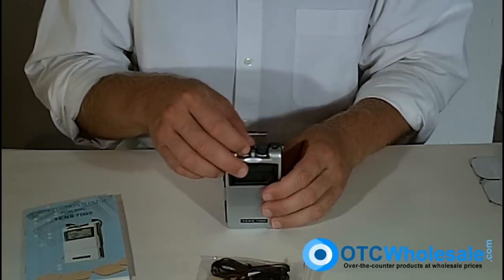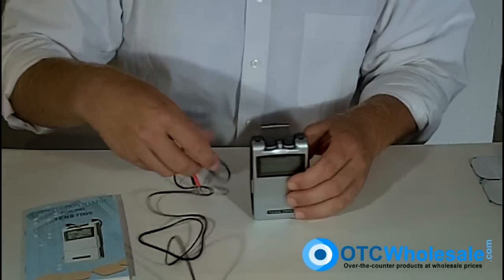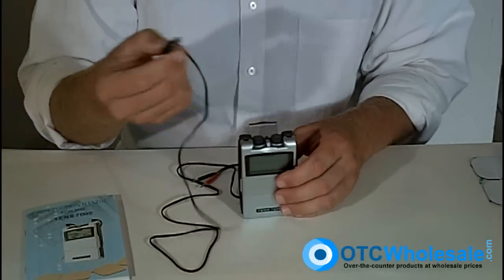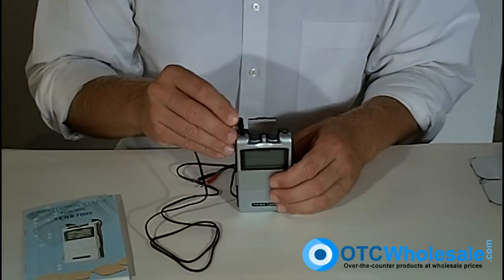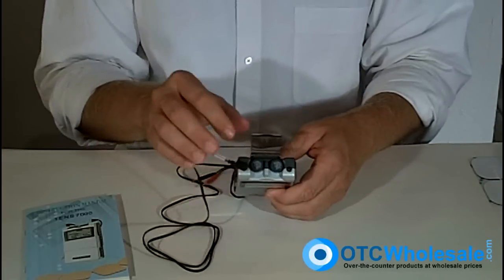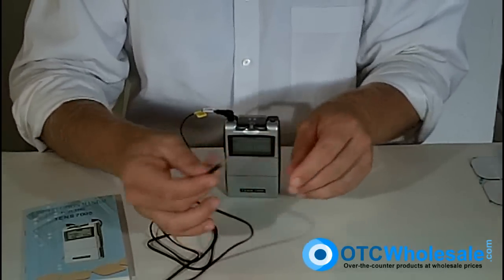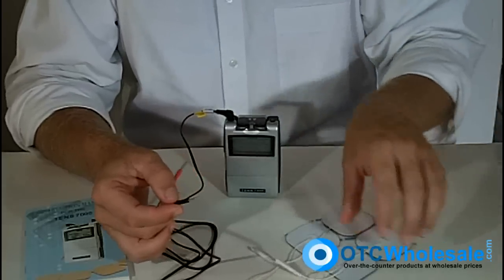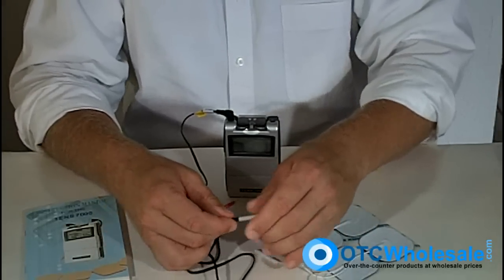The wires look like this — standard TENS wires. We have plenty of replacements at OTC Wholesale just like this. You simply put the wire in the top like that; that's channel one, and they have an eighth-inch pin connector. I'll bring these silver electrodes back to show you how that works — it goes right together, just like that.